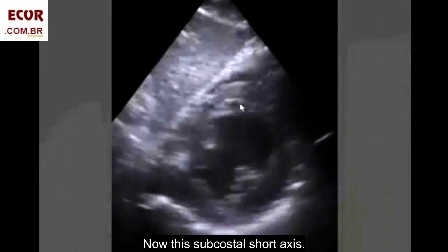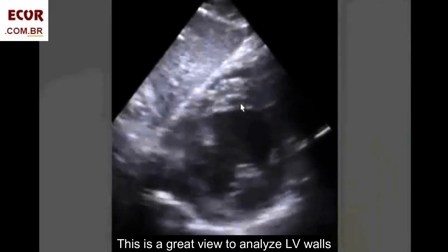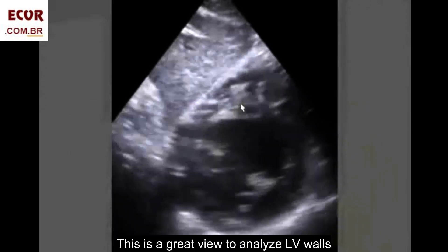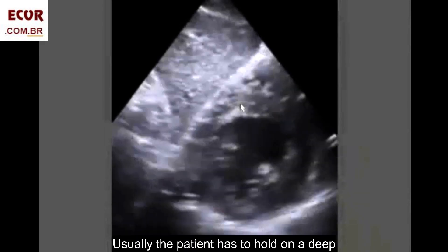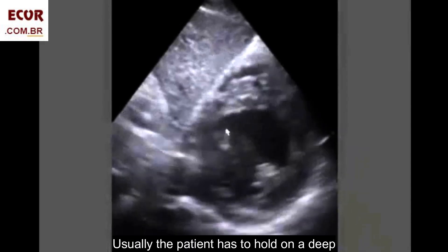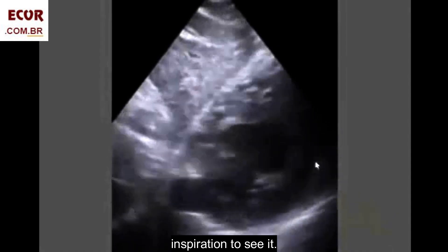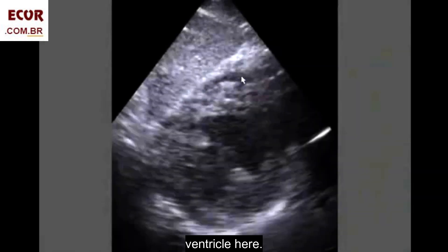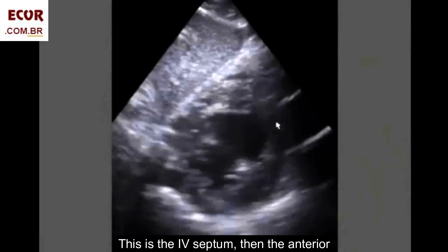Now, the subcostal short axis. This is a great view to analyze LV wall contractility. Usually the patient has to hold a deep inspiration to see it well. Just to remember: while we have the right ventricle here, this is the IV septum.